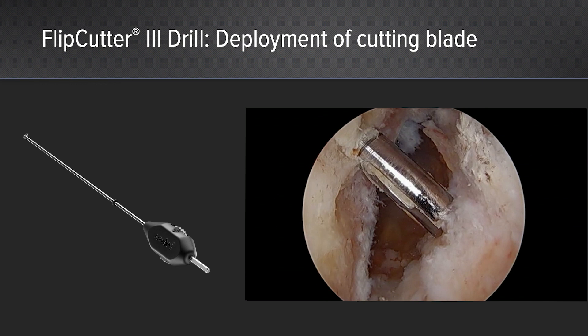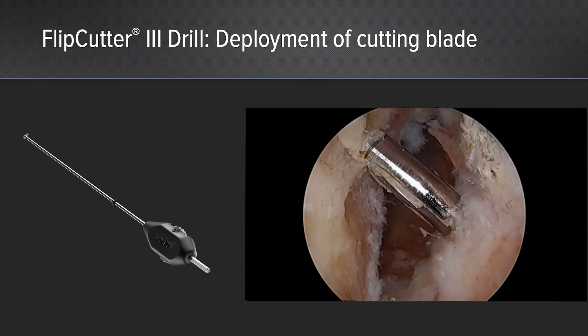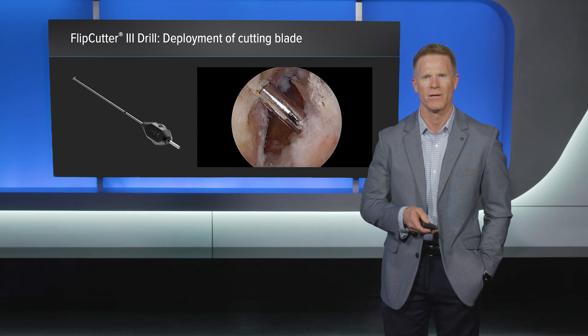We then turned our attention back to the knee to begin our tunnel preparation. Using the femoral 6-9 guide, we drilled our flip cutter 3 and visualized its entrance into the joint. Once the flip cutter 3 device was visualized, we activated it and chose our tunnel size to correlate with a 9.5 millimeter socket. We chose a 9.5 socket here even though the graft was originally 10.5 millimeters. That compression of the graft during graft preparation allows for graft re-expansion later on to improve our fill of our socket.